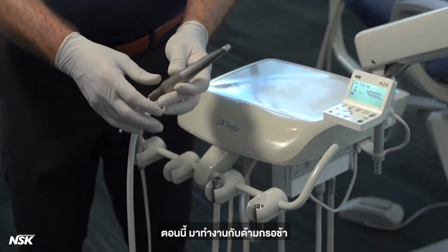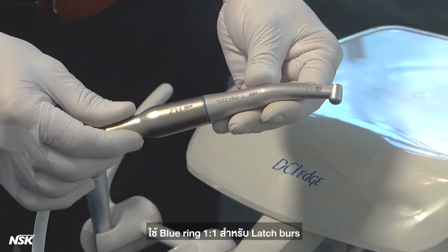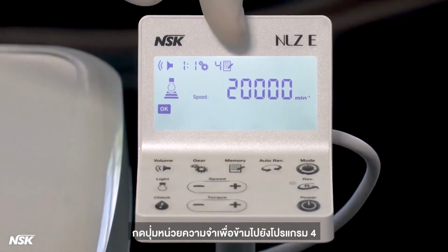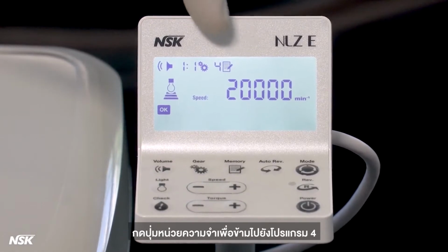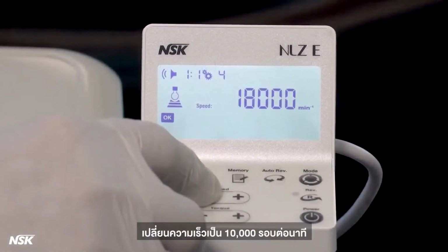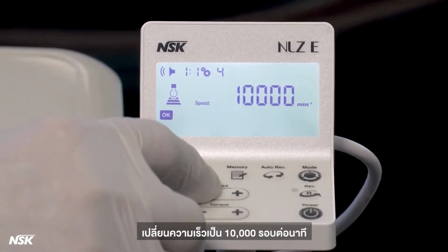Now, let's work with a slow speed attachment using a blue ring 1-to-1 for latch burrs. Press the memory button to jump to program number 4. Set the gear ratio to 1-to-1 this time. Change the speed to 10,000 RPM.